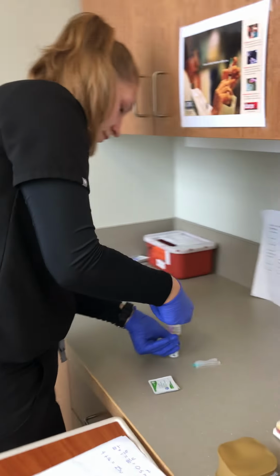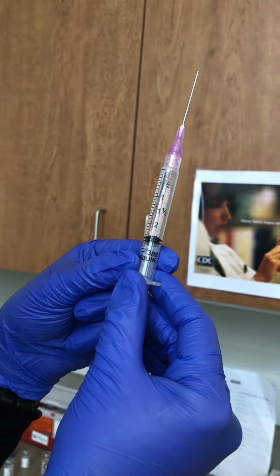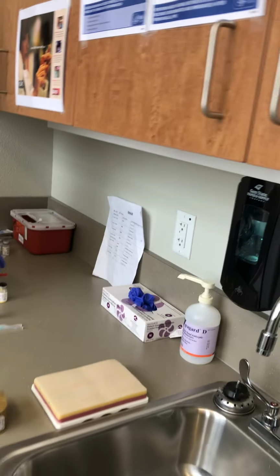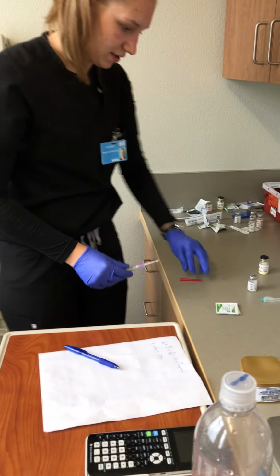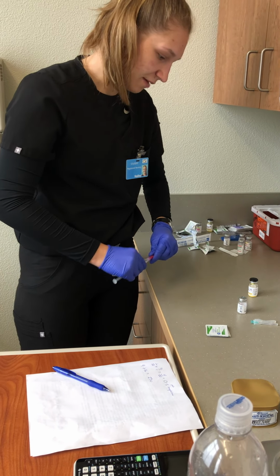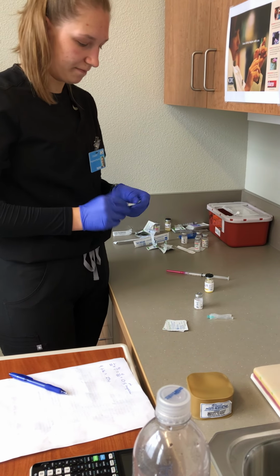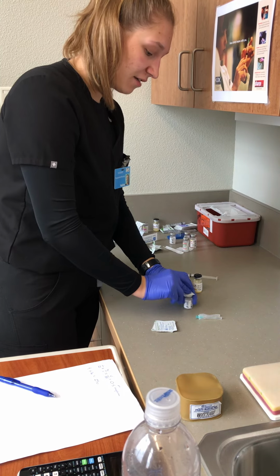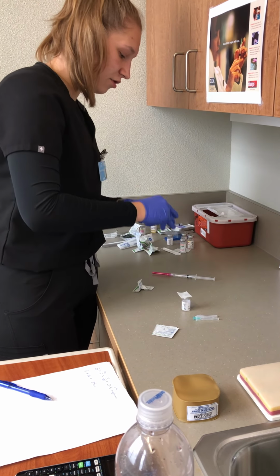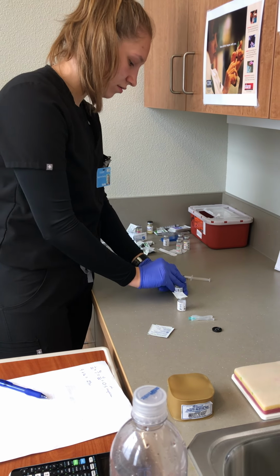Okay, go. So I have 2.5 milliliters of dilute, and I'm going to recap this because I forgot to take off the top, the other one. And before I would have pulled that up, I would have wiped it down with an alcohol swab. Forgot to do that, but I would have done that. And now I'm going to open this. I'm going to go ahead and wipe it down.